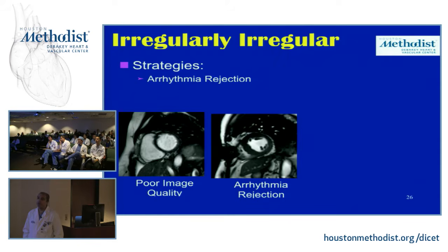So how do you tackle that physiologic problem? It's not technical, that's physiologic. Because when you report the EF, you might be reporting an EF that looks too low because it was taken with a short cycle, right? So how do you handle that one? Yes, that's a good one, and that's what I'm going to get to on the next slide.